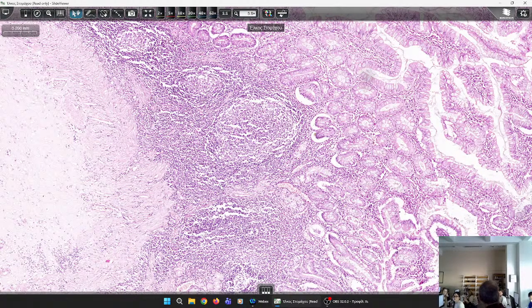However, there would be a possibility, if we had atrophy in the previous slide, that we have an immune gastritis in the oxyntic mucosa, which, when destroying the mucosa and making it atrophic, would cause hypochlorhydria, and this would lead to a defective secretion of the intrinsic factor, and thus vitamin B12 could not be absorbed in the small intestine.